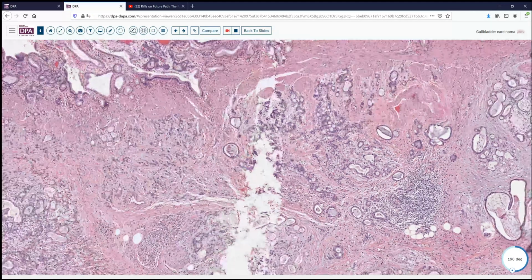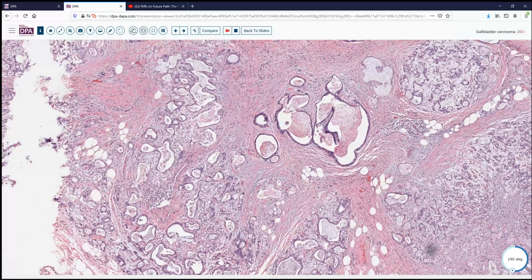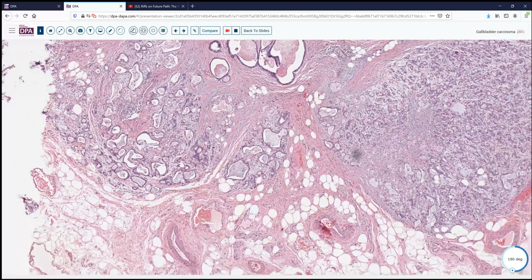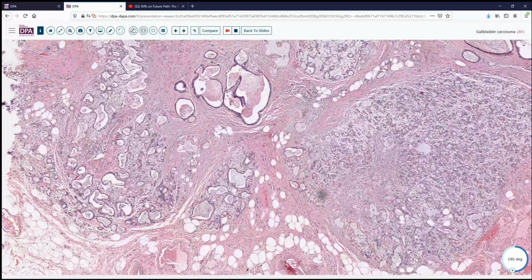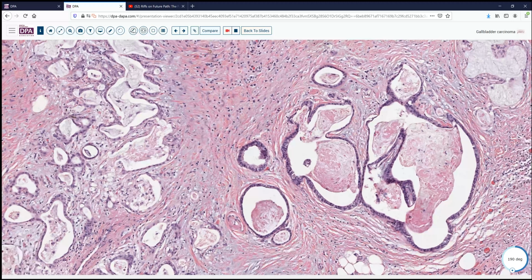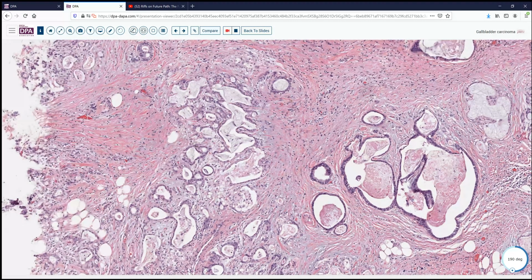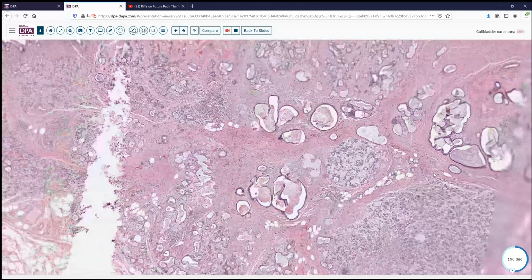Now, very often, gallbladder carcinoma will invade the adventitia and line up to find the nerves and other paths of least resistance. So it's certainly appropriate to look for perineural invasion in areas like this around vessels. We're not seeing that right off here. Also, we'll just call attention to this sort of an area here. And notice the difference in staining character between these glands and the ones surrounding them. It's very possible that these are entrapped Rokitansky-Aschoff sinuses that have been surrounded and impressed upon by the tumor, although there may be some tumor associated with them. But very often this picture can become quite confusing, and distinguishing between otherwise benign Rokitansky sinuses or adenomyosis can become very challenging for us in gallbladder carcinomas.